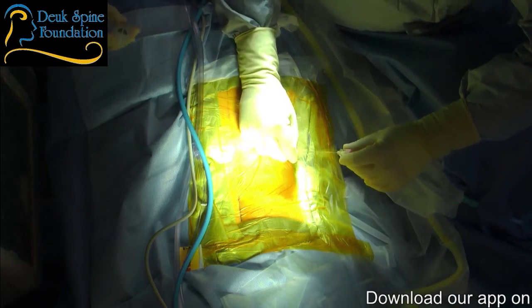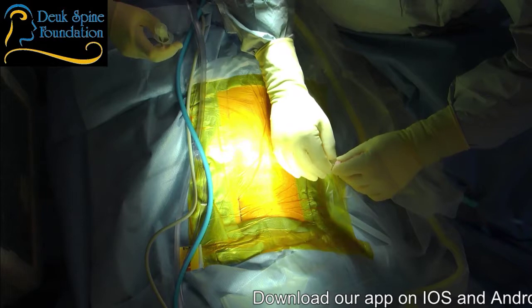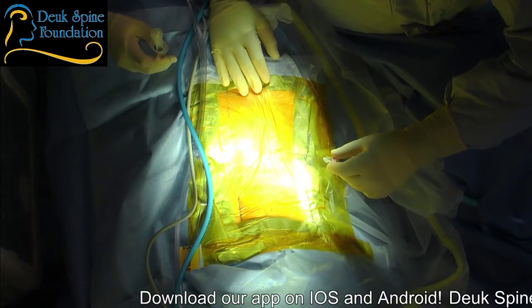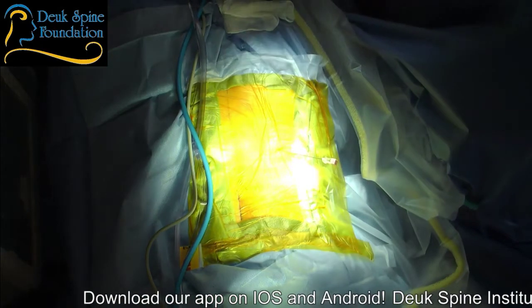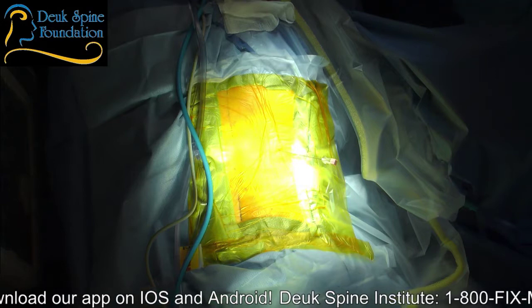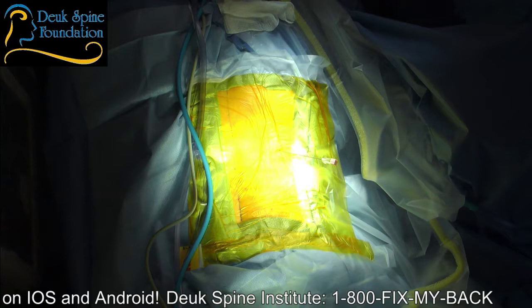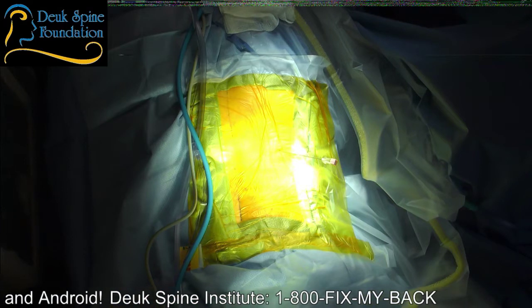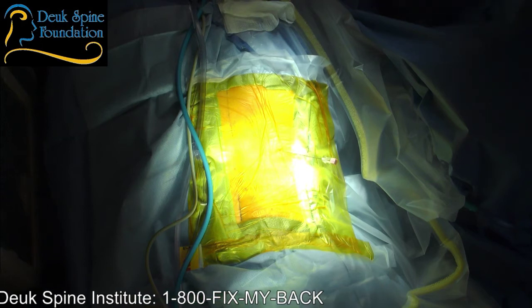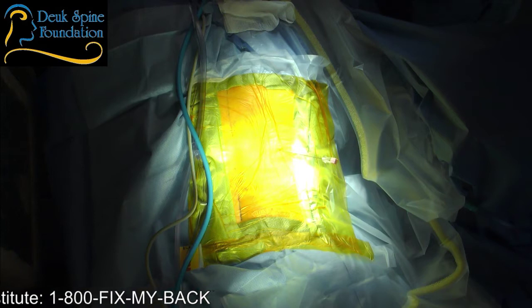Now, I'm going to be talking to everybody while I'm doing your surgery. I'm going to be talking to my team, and I may even talk to you. But you're going to hear me say shot, and what that means is I want an x-ray picture. Shot. No problem. Take your time. All right. Let's figure it out. Yeah, bring your fluoro base.